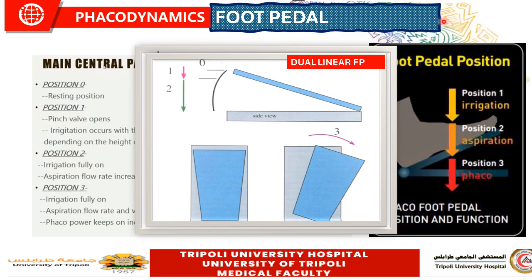However, in the double foot switch, you can jump or switch to the ultrasound mode from stage 2. You need not have the full parameters of stage 2 fulfilled to reach ultrasound.